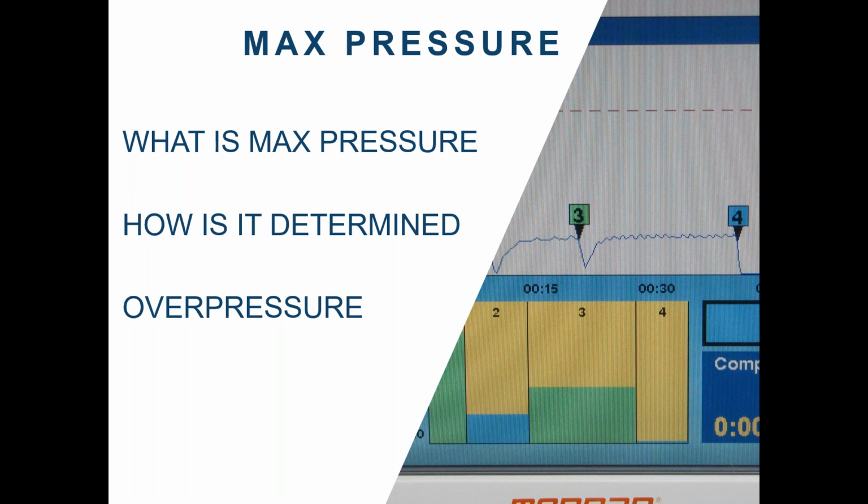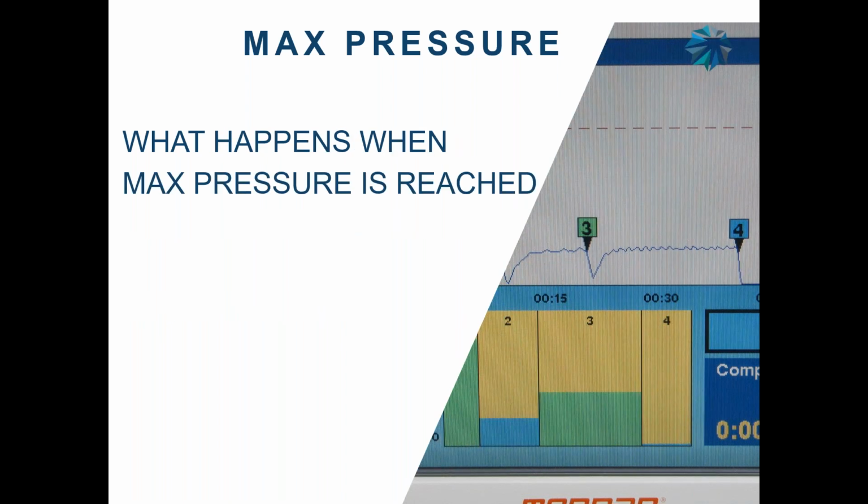What happens? Infusion guys, girls? Injection stops. It stops. We have a problem. Stop. There's an occlusion. There's something wrong. Stop. What happens when max pressure is reached? Yes, it maintains. How does it maintain? Who said that? I can't see your mouth speaking. How does it maintain?